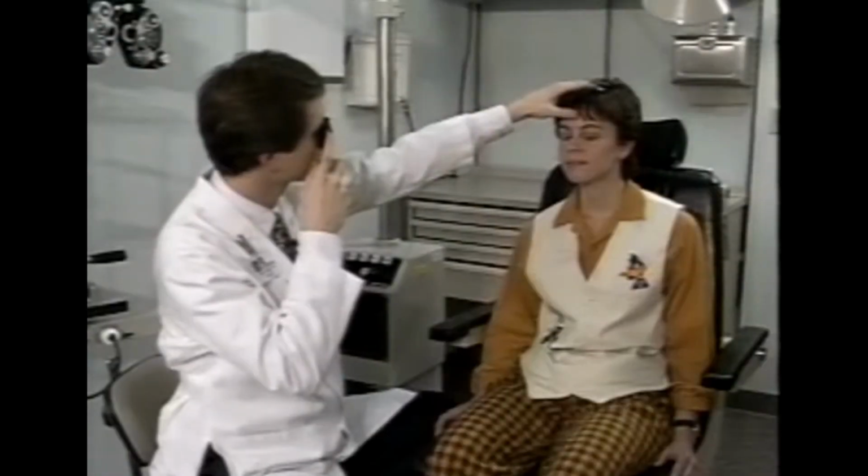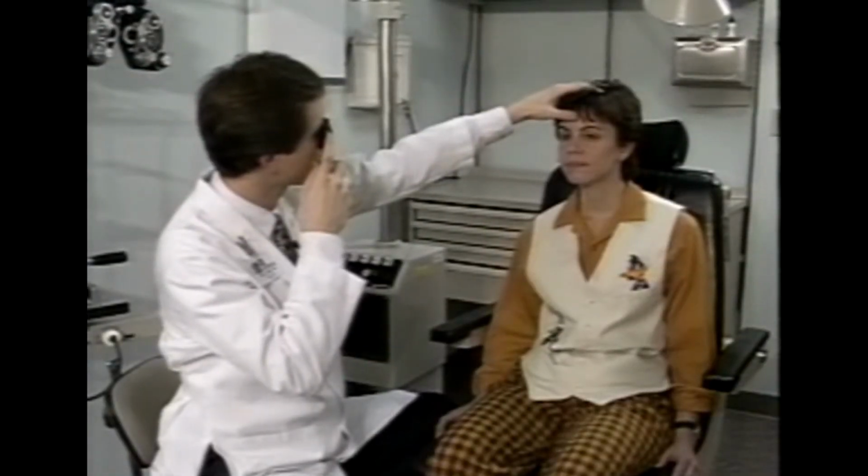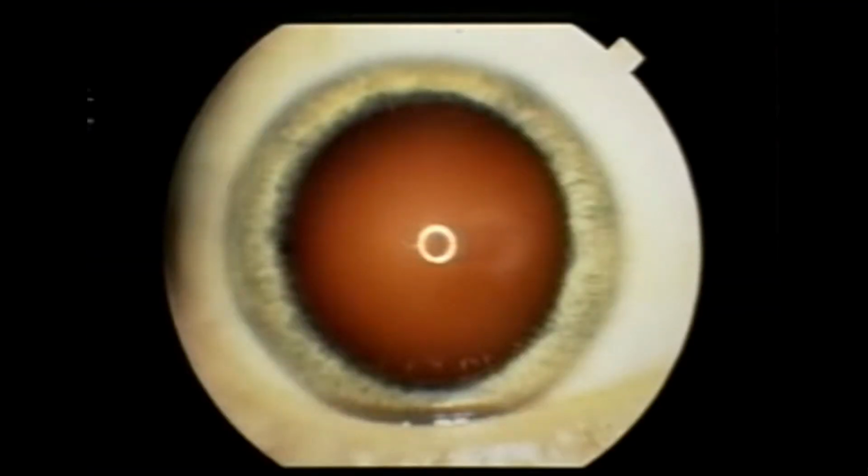Your right hand and your right eye should be used to examine the patient's right eye, and your left hand and left eye to examine the patient's left eye. Failure to do this can put you nose to nose with your patient and result in a very awkward situation. First, at arm's length, focus on the front part of your patient's eyes, looking for a normal red reflex. A normal red reflex indicates that there's no obstruction between you and your patient's retina.